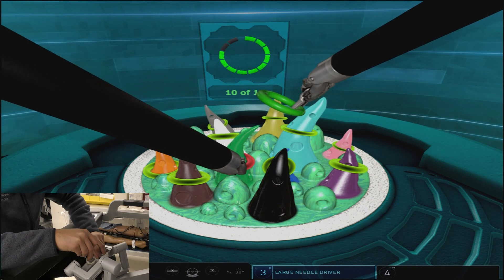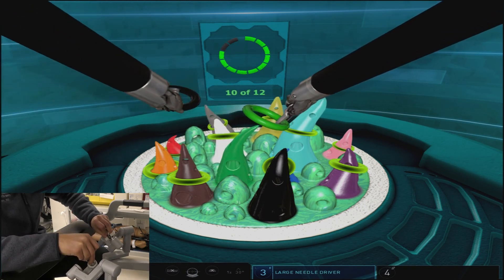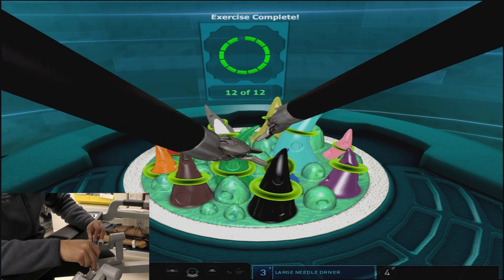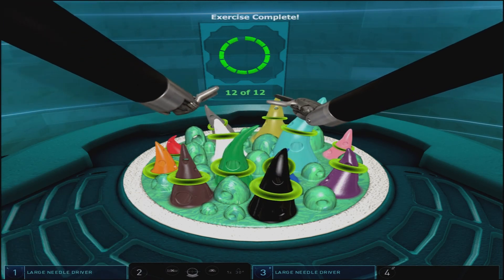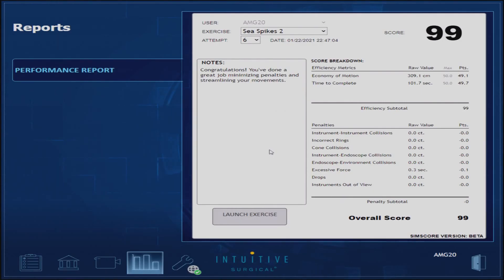Here we're being extra cautious as we remove the incorrect ring from the green cone so as not to hit the brown cone and cause penalties. As mentioned before, success in this exercise comes from minimizing collisions and having good efficiency in the coordination of the left and right arm.